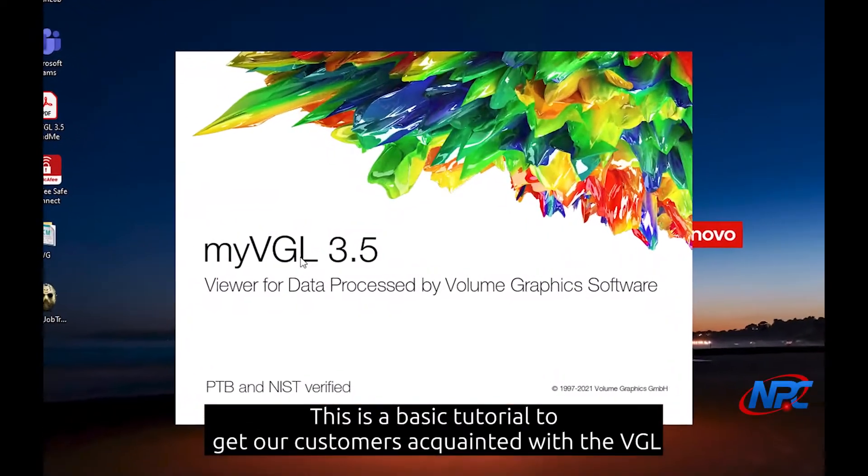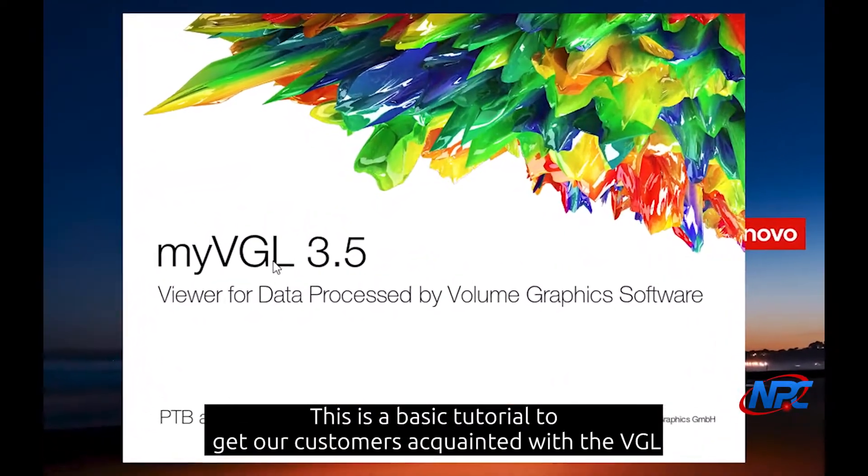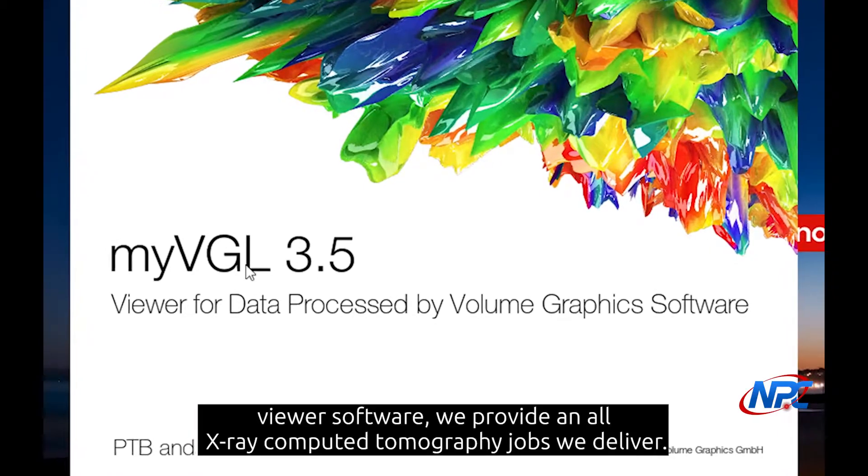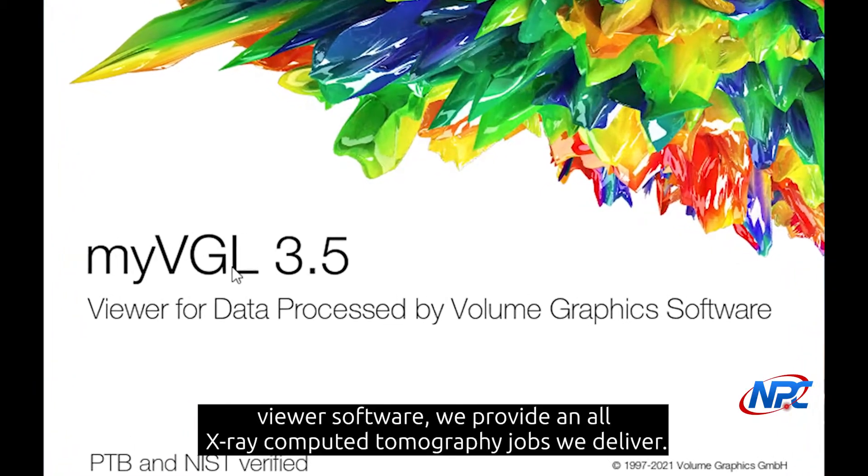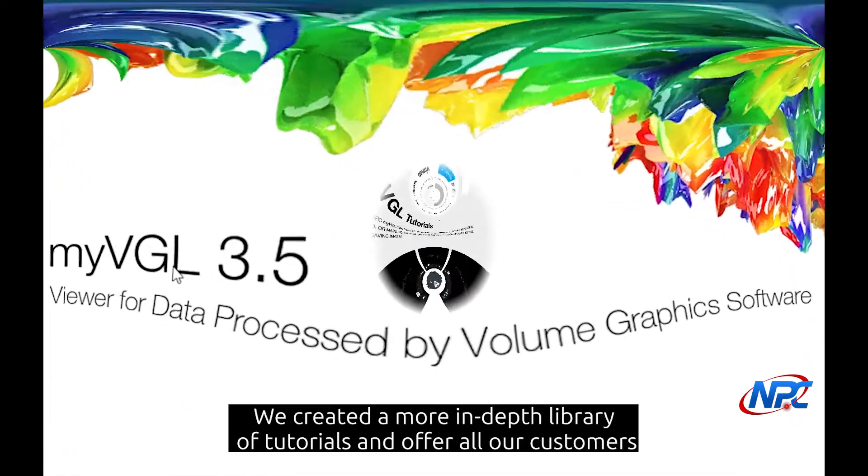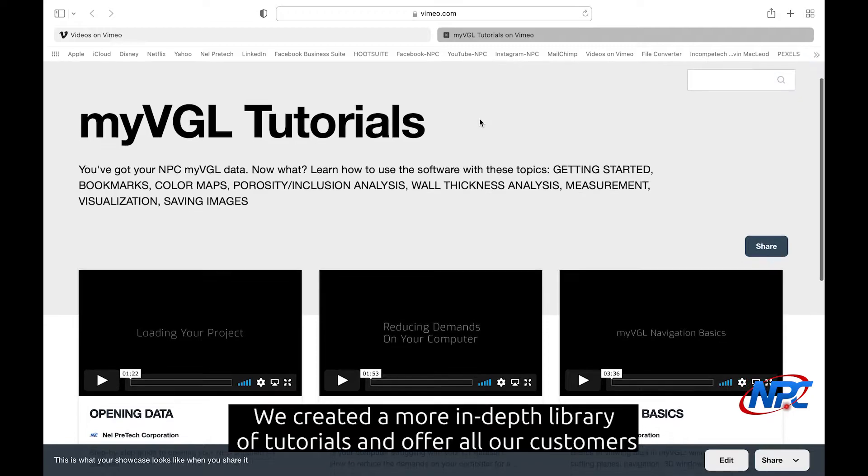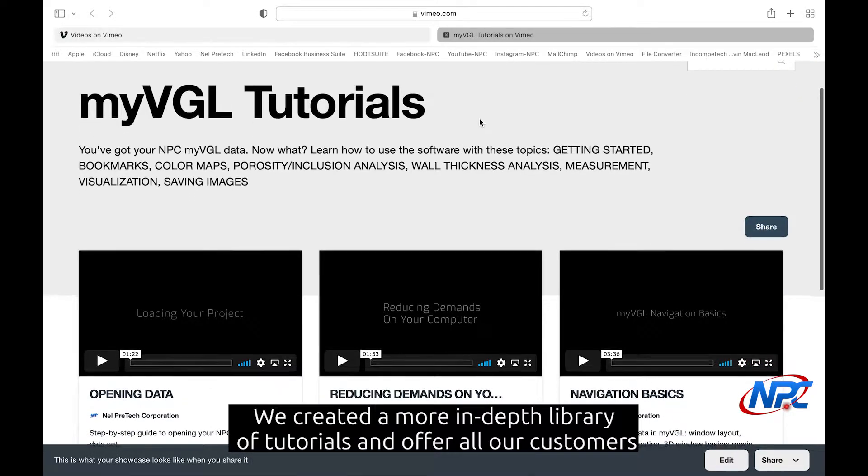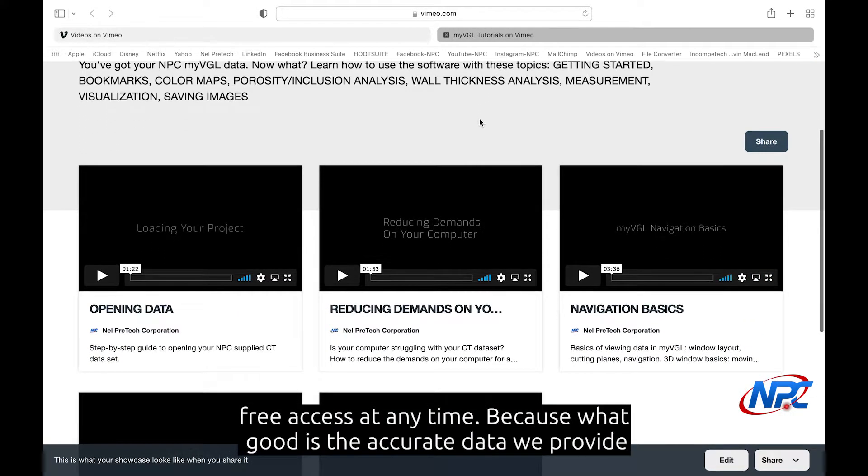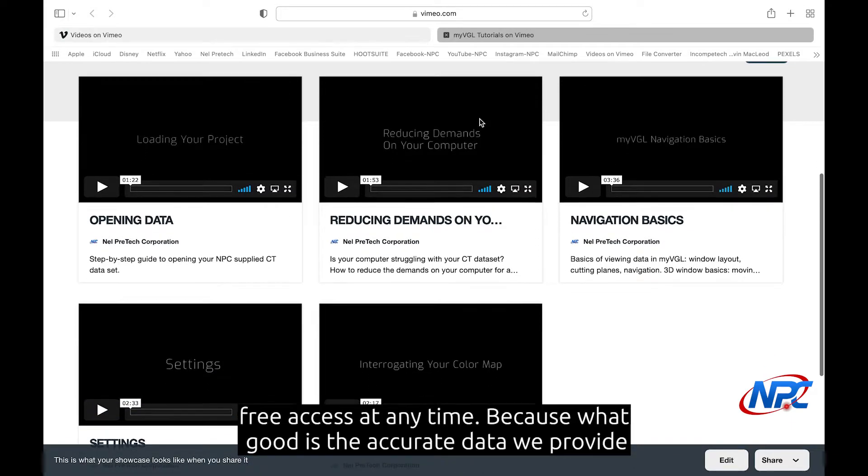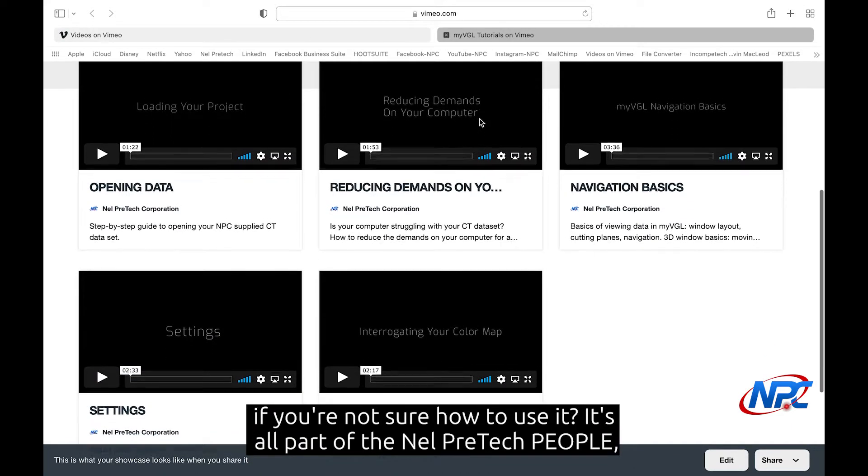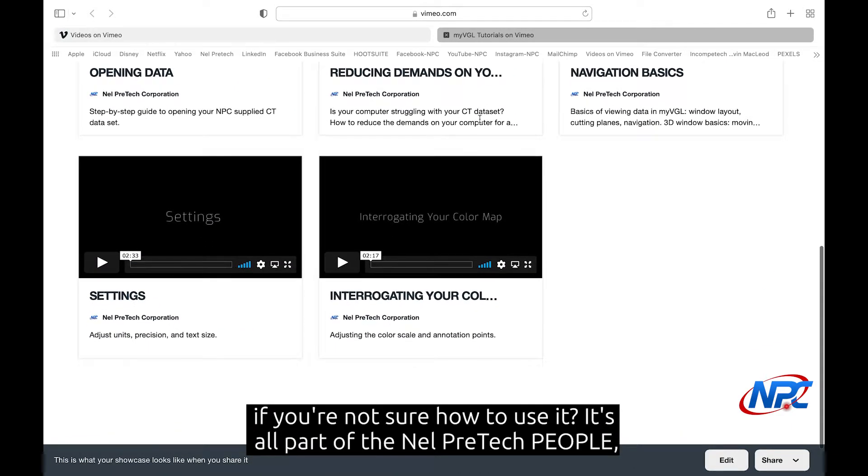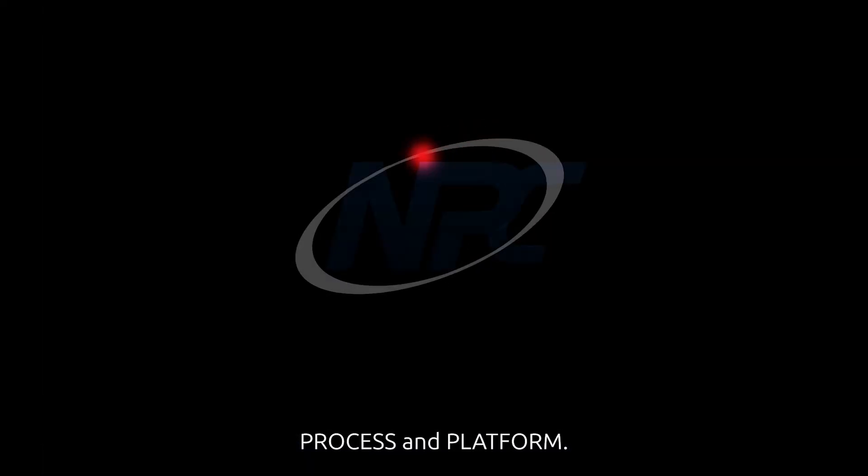This is a basic tutorial to get our customers acquainted with the VGL viewer software we provide on all X-ray computed tomography jobs we deliver. We created a more in-depth library of tutorials and offer all our customers free access at any time. Because what good is the accurate data we provide if you're not sure how to use it? It's all part of the Nell Pre-Tech people, process, and platform.